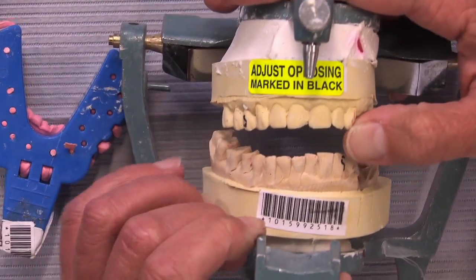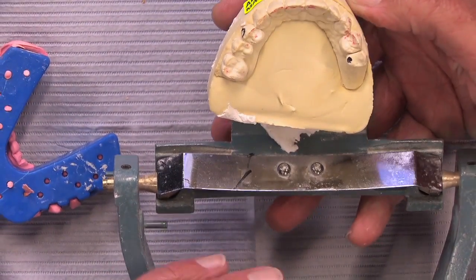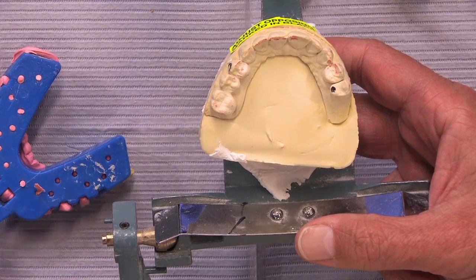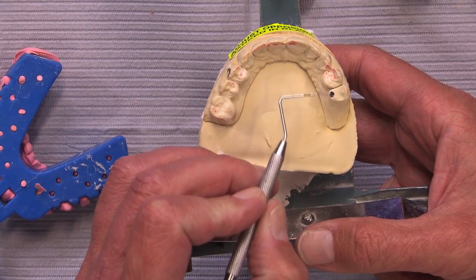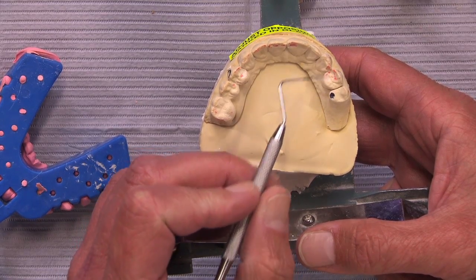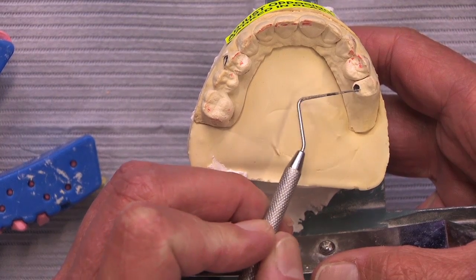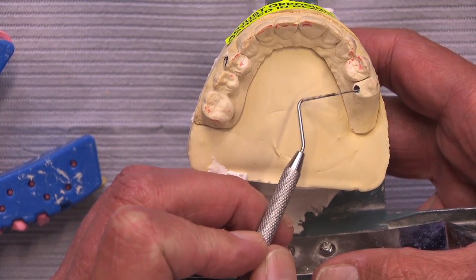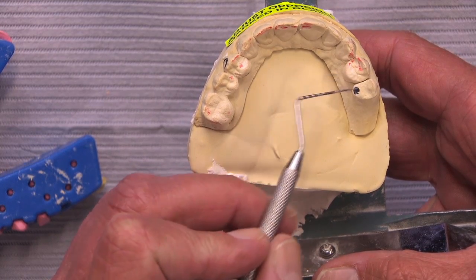And so anytime you receive something from us where you have the adjust opposing marked in black, without a reduction coping, it's usually just going to be something like this. And again, our technicians will do this with a straight tapered diamond. I have talked to them countless times about this: hey guys, this stone model, I know it's really easy to go in and adjust this, but guess what? In the patient's mouth, this is an actual tooth, this is actual enamel, this is precious tooth structure. We want to reduce as little as possible.